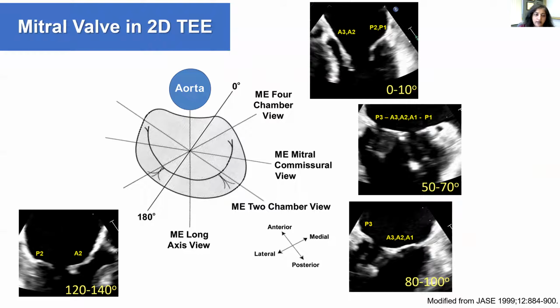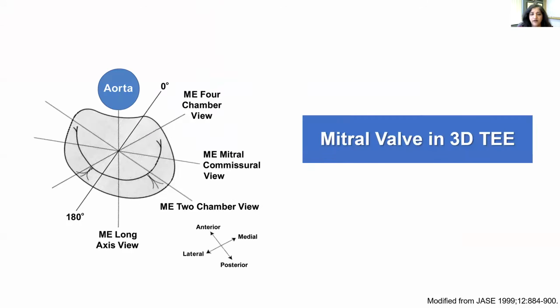This is a great way to look at the mitral valve, and you get a lot of information on mitral valve anatomy and leaflet anatomy. You have outstanding image resolution and can evaluate vegetations, clefts, other types of pathology. I find the true value of mitral valve visualization in TEE to be in 3D. And we're going to talk a little bit about 3D in the next section.